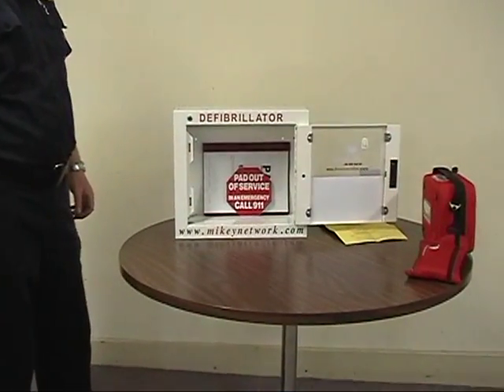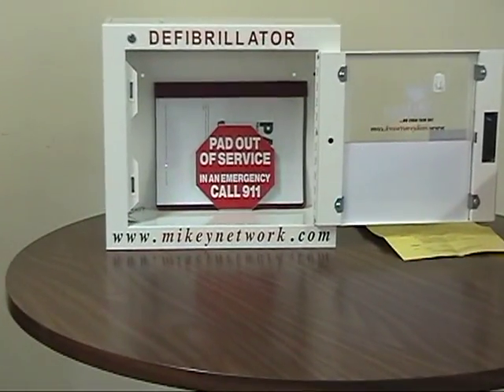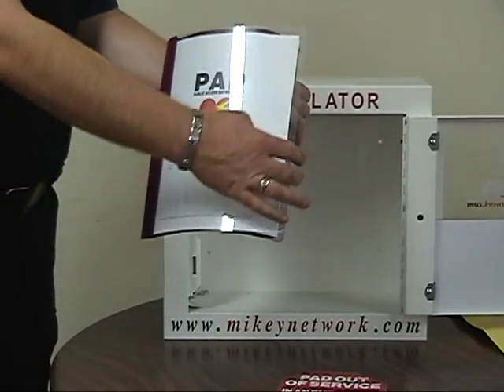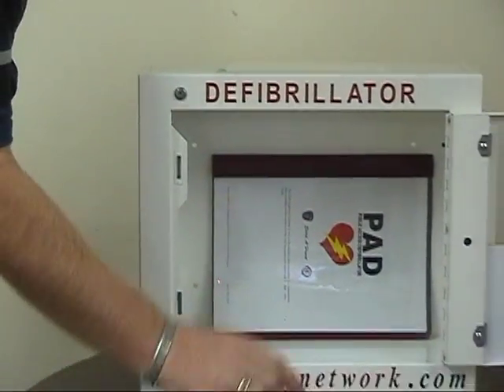Ensure that at the back of the response case there is a post-pad use booklet and a stop sign. These two items are important if there's a problem with your defibrillator.